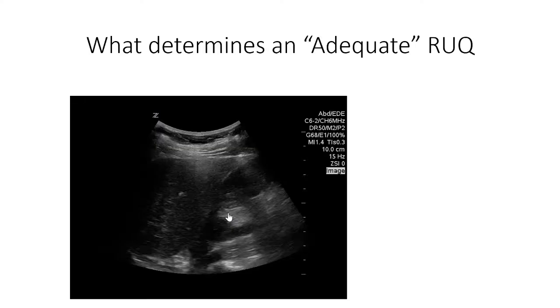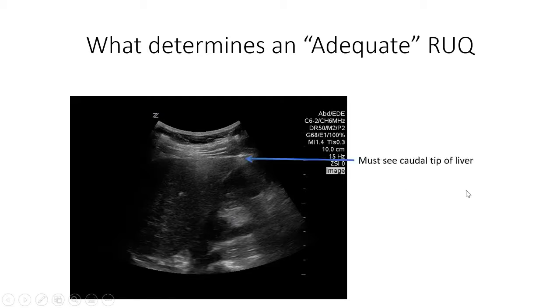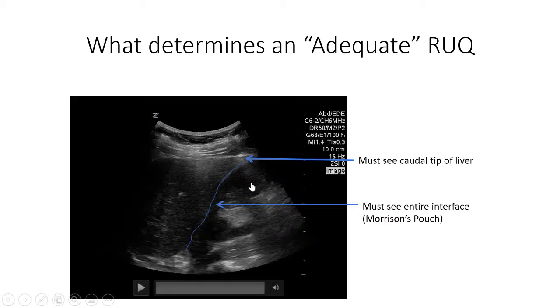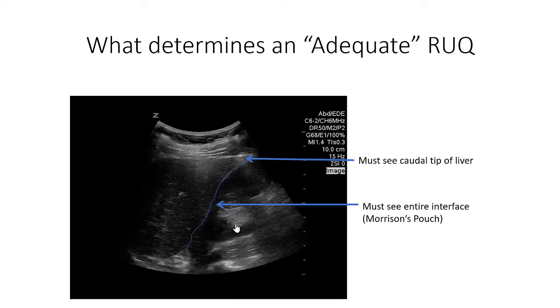What determines an adequate right upper quadrant scan - how can I say I've seen enough to call something negative? For the right upper quadrant, you need to see the caudal tip of the liver and the entire interface between the kidney and the liver, known as Morrison's pouch. If there's no fluid in Morrison's pouch, you can see all the way to the caudal tip, and you've swept through such that the kidney disappears on both sides with no fluid visible, you can call that a negative scan. Fluid at any time in the interface or around the caudal tip is a positive scan.